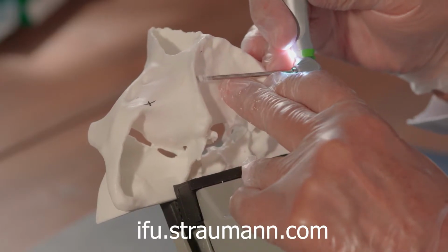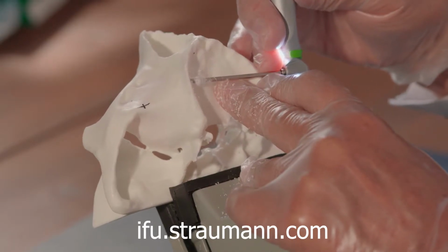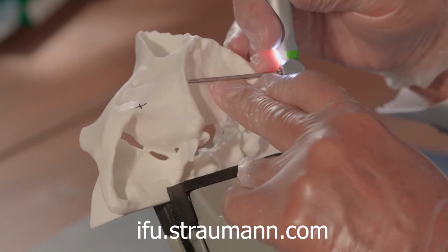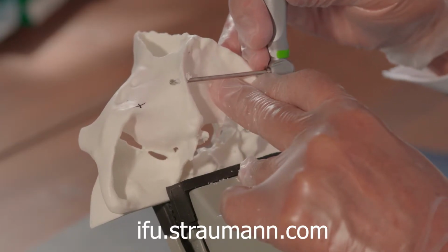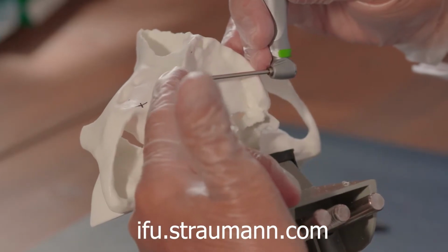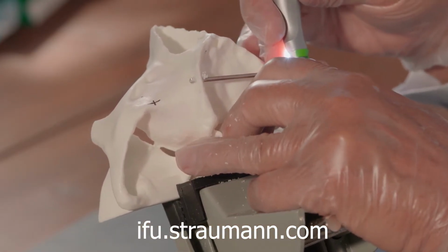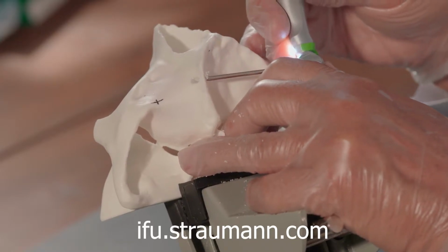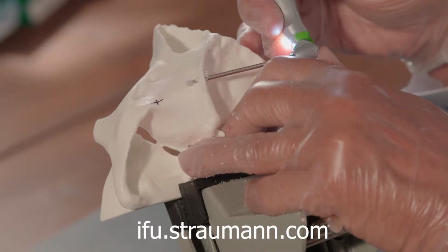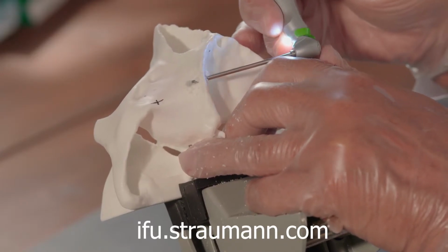As you may see, I'm pointing, and now we have the drill appearing up there. So now we are drilling back and forward, and the drill is going to drill on the back movement, not on the forward, but on the back movement.